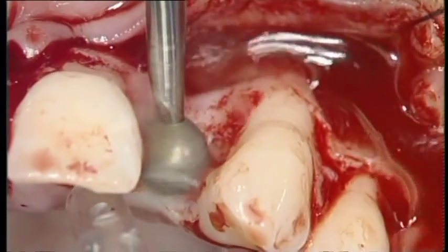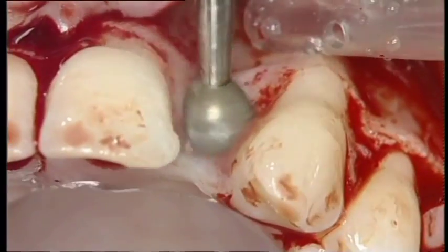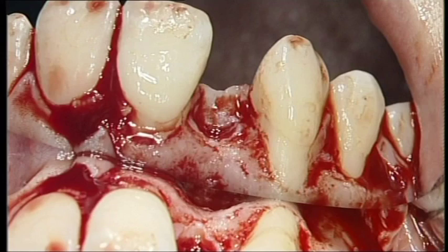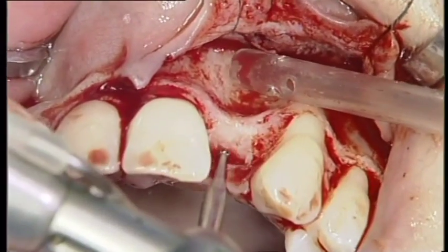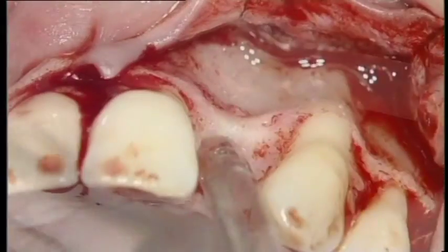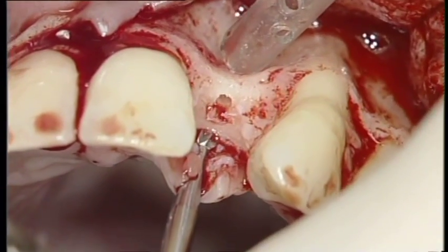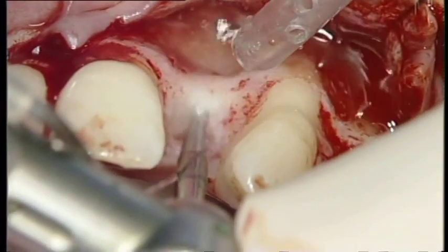Implant bed preparation is started with a large diamond burr to smooth the coronal part of the alveolar crest. The mirror view shows the well-scalloped bone structure in harmony with the neighboring teeth. Then a number 1 round burr is used to mark the appropriate implant position. The preliminary marking is enlarged with a number 2 round burr, giving careful attention to keep sufficient distance from both adjacent teeth.